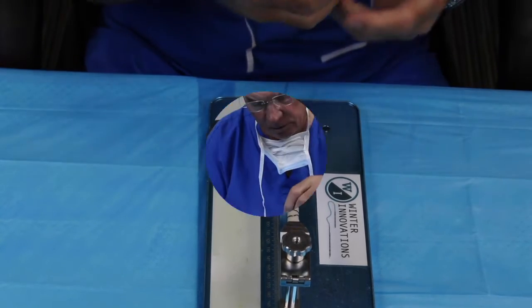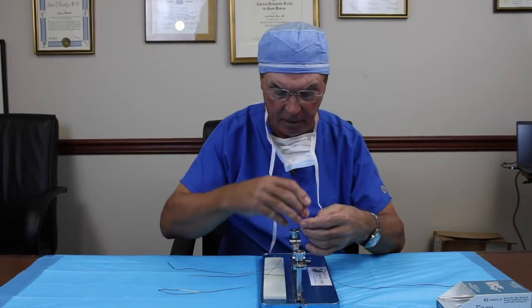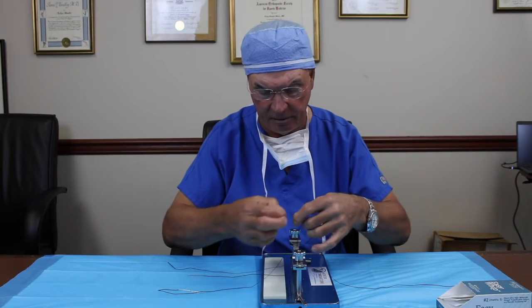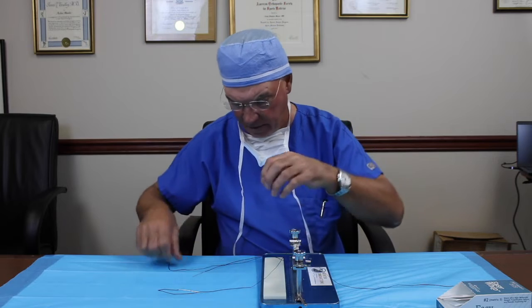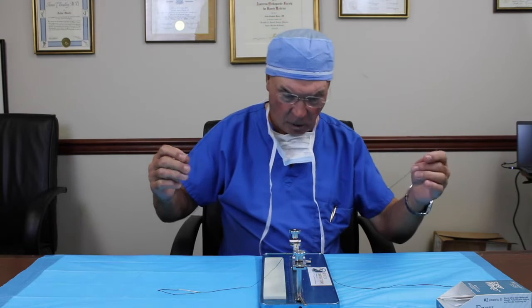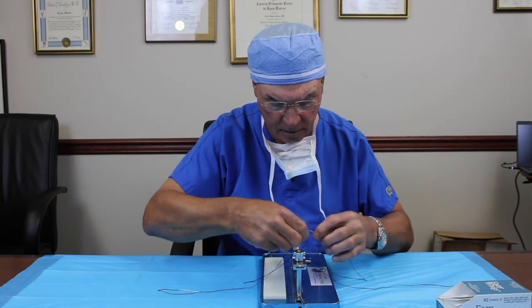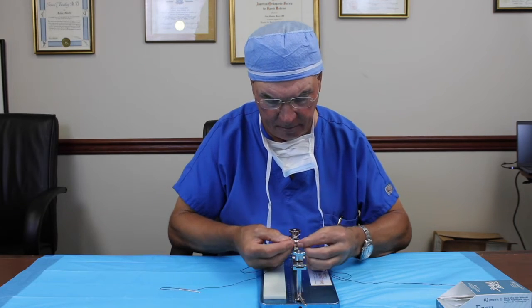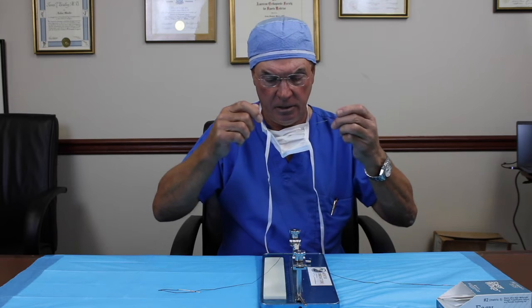So you go down under. When you separate it, you just leave the ends. You get this little baby figure of 8 up here, and you just make sure that you've got your fingers in there, and you just separate them like so. Then you take the ends, and you make sure what side you're on is what side. You stay on the same side. So in other words, this belongs on this side, this belongs on this side, and you simply put your fingers through like that. I like to make a little tiny X. It's easier for me to do it that way. And then you tension them down.